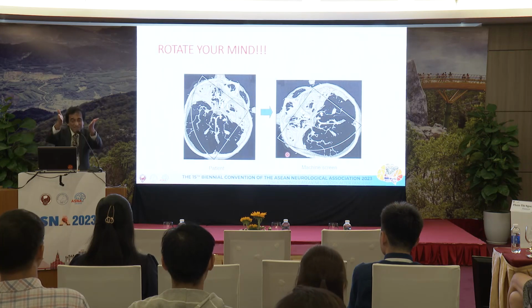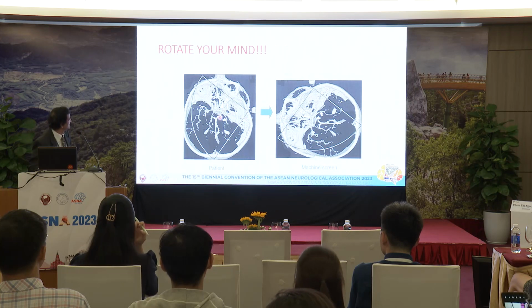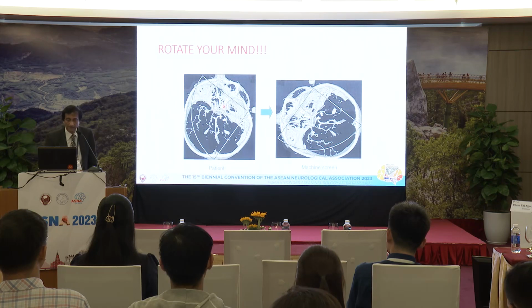So here, the patient is lying down, the patient is here, the probe is here, right? You're seeing all the beautiful blood vessels through this window. You're seeing, for example, here, the middle cerebral coming over here, anterior cerebral here, posterior cerebral over here, all from this window. You can see it all, and you can find the terminal ICA just a bit below.